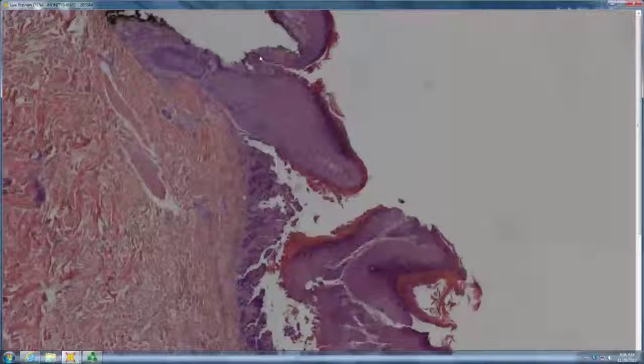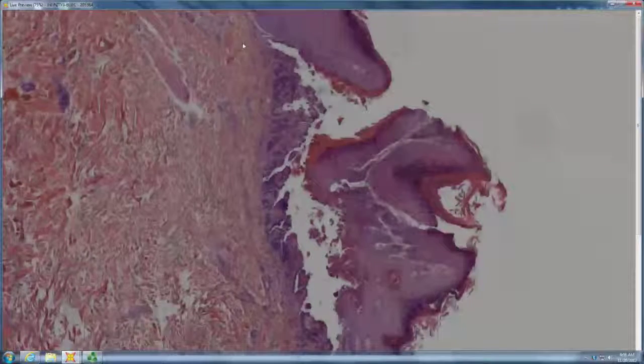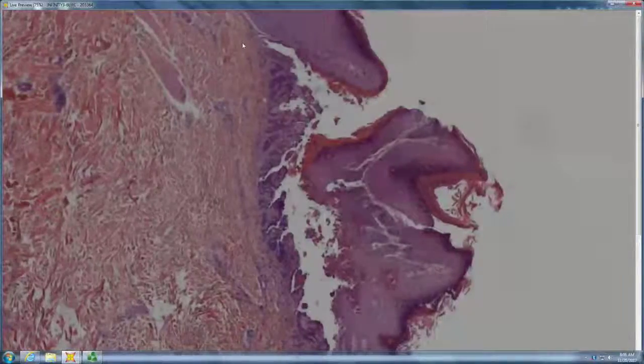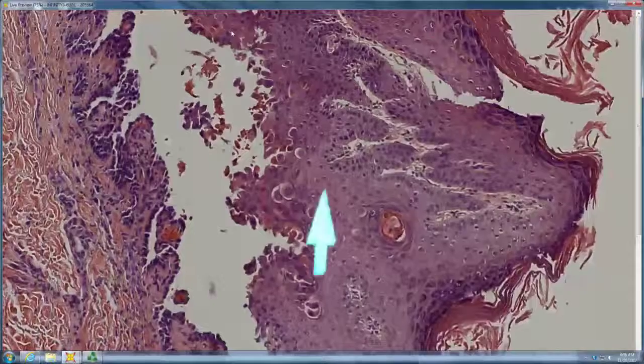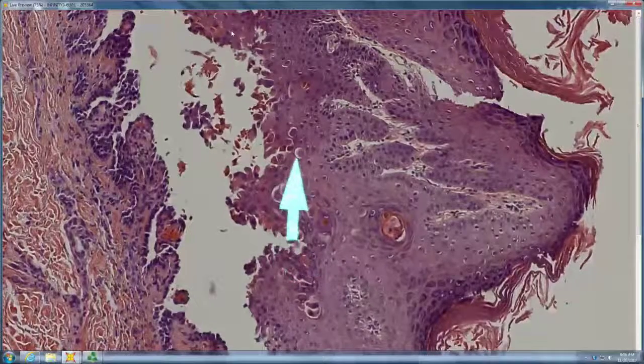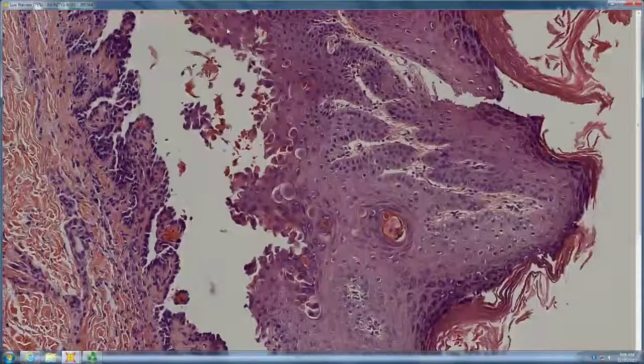It's kind of an endophytic lesion, slightly. There's some acantholysis and some dyskeratosis. So thinking of warty dyskeratoma, perhaps. Yeah, so if it's a solitary lesion, warty dyskeratoma, it's a Haley pattern, right?